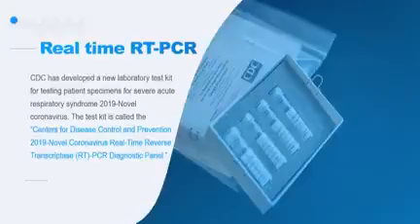CDC has developed a new laboratory test kit for testing patient specimens for severe acute respiratory syndrome. The test kit is called the Centers for Disease Control and Prevention 2019 Novel Coronavirus Real-Time Reverse Transcriptase Diagnostic Panel. This test is intended for upper and lower respiratory specimens.